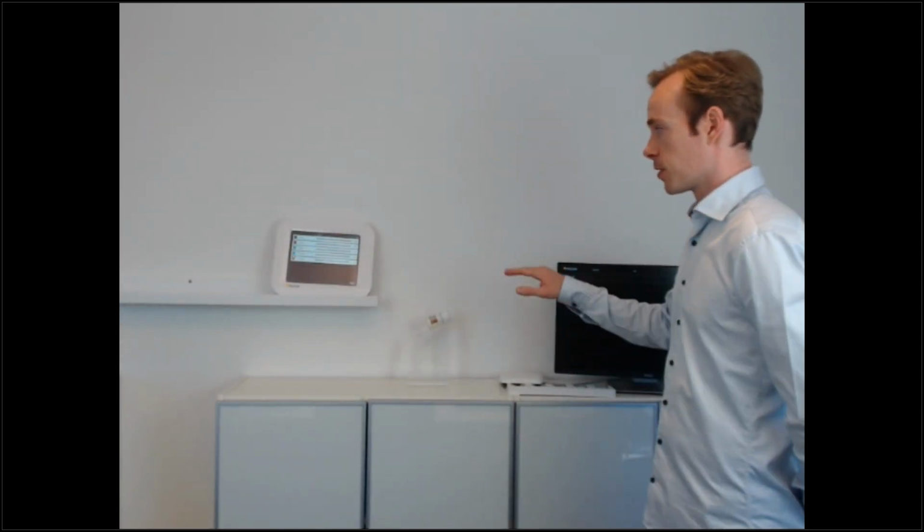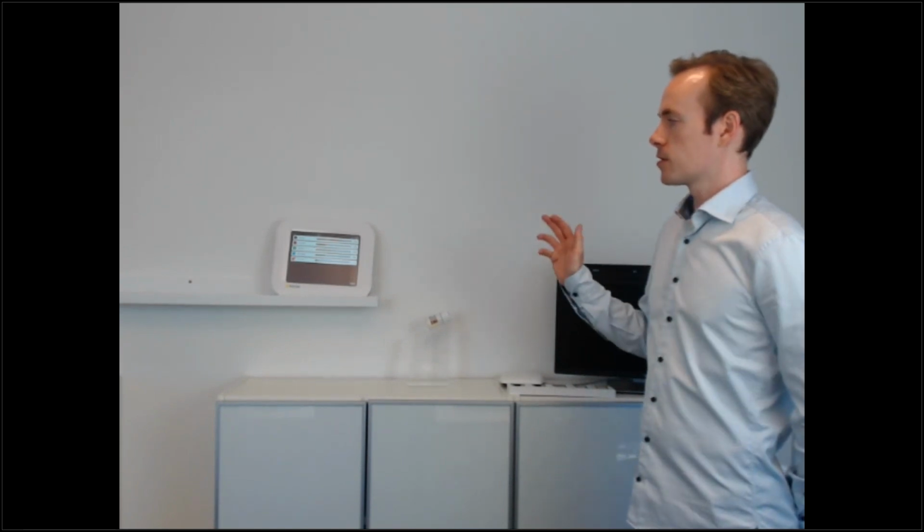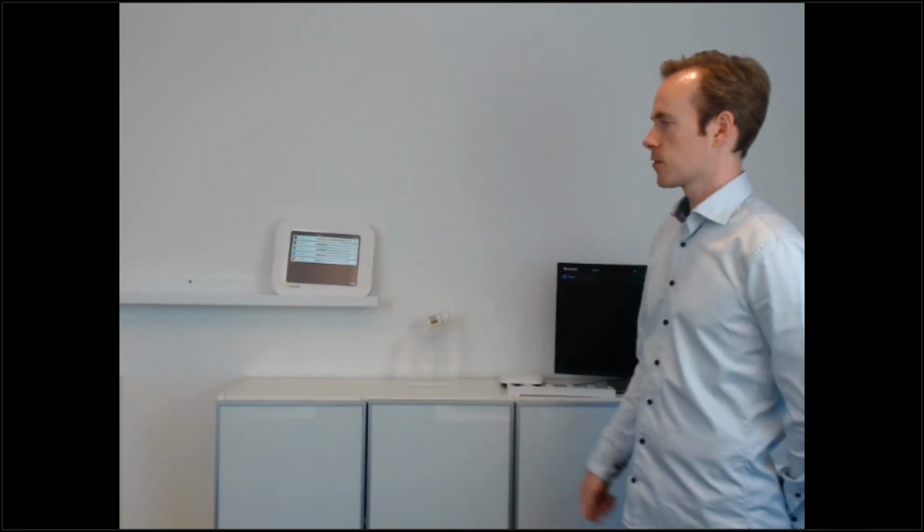What happens if there is a power shortage or a power cut of the display? Is the measurement lost? No, the measurements are still stored. Same thing for both units. So the measurement data is non-volatile. If you have a power shortage or a power outage, it would of course turn off, and then it would automatically turn back on when you get power.